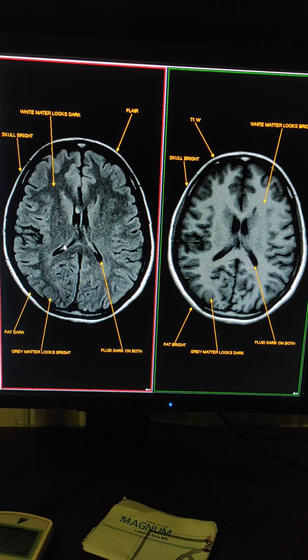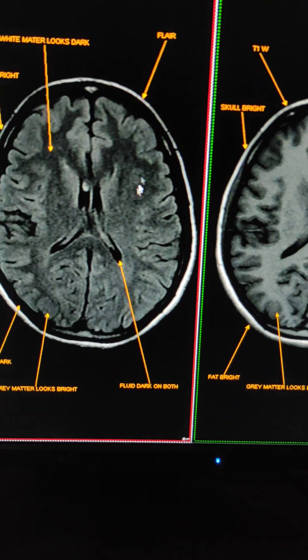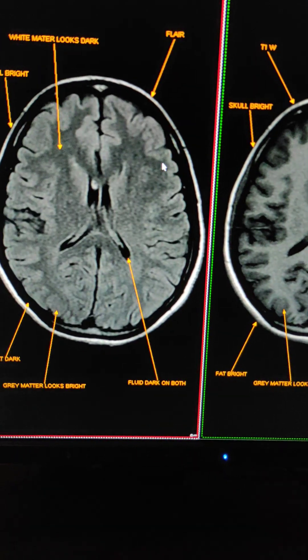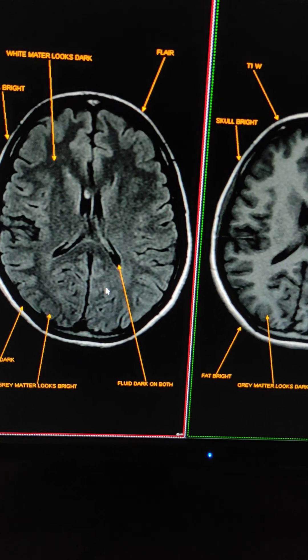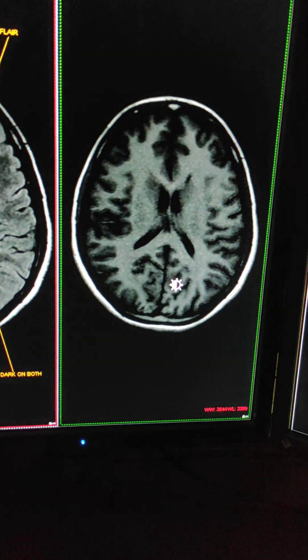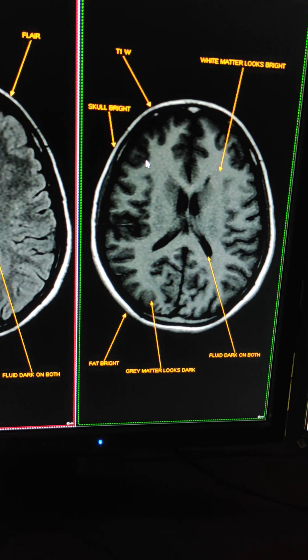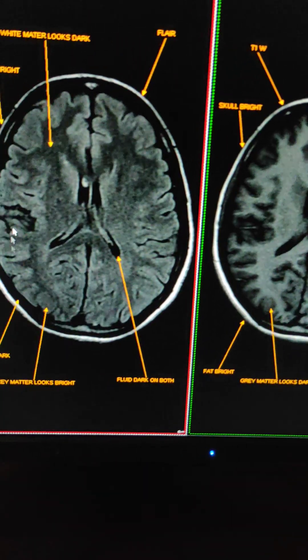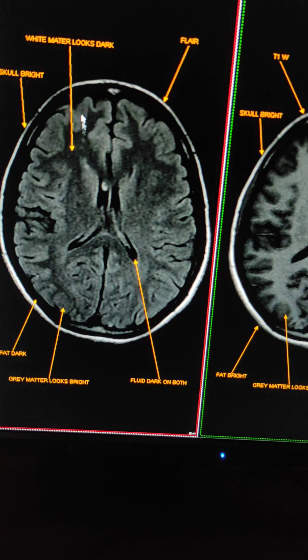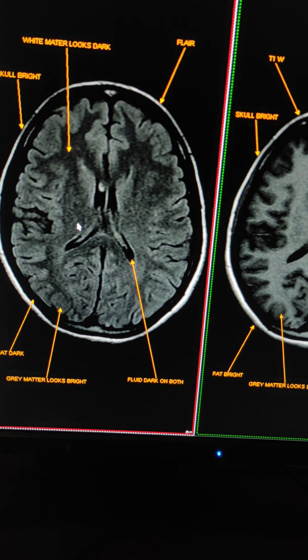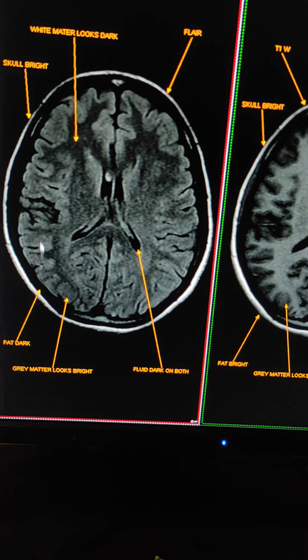The very main thing to differentiate is gray matter and white matter. While you are changing the level window, you can identify which is FLAIR and which is T1. When I change the window of T1 weighted sequence, white matter is bright and gray matter is dark. When I change the FLAIR window, white matter looks dark and gray matter is bright.